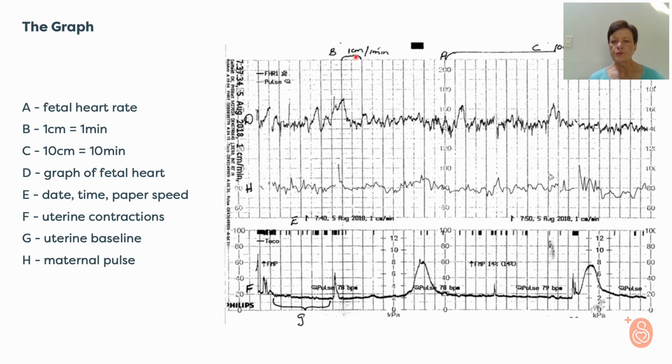It also helps us, if we want to determine, for example, how long that acceleration was, we can see it's almost a minute long. It helps us to determine, although I've said we can't accurately determine the duration of the contractions, but to a certain extent it can also help us to determine more or less what the duration of the contractions were.